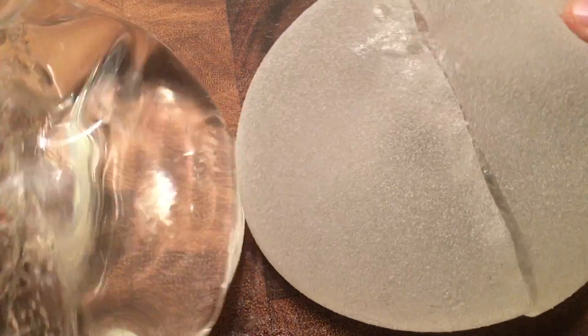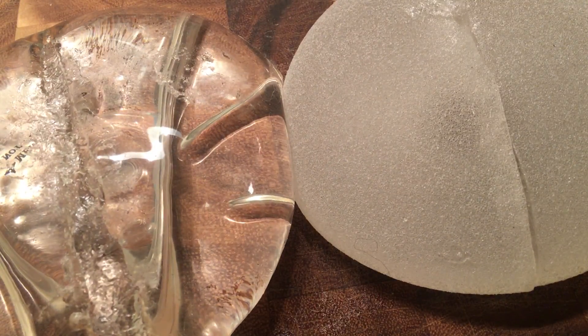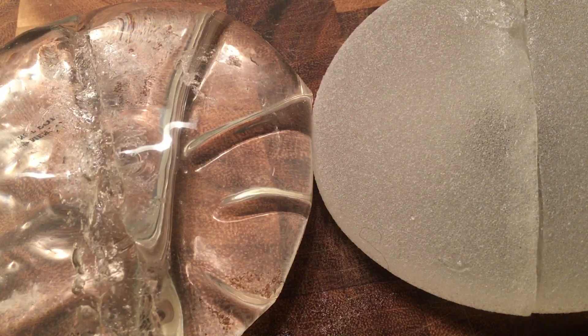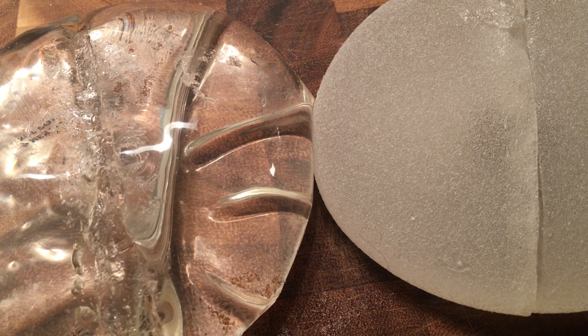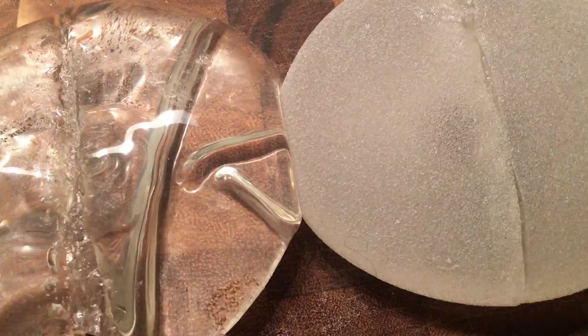So those are the differences between the two implants. They're both excellent options and rest be assured if you ever have a rupture and hopefully you won't, if you ever do, these aren't going to be spilling silicone all over your body. Your body will wall these off and protect you. But in either case whether you have the more modern silicone gel or the more recent gummy bear, they're both going to stay relatively cohesive within the body.